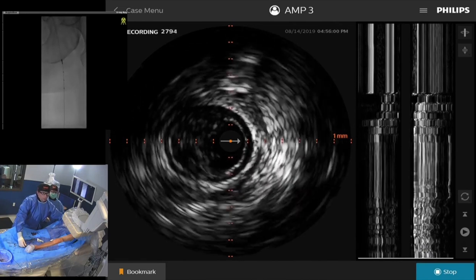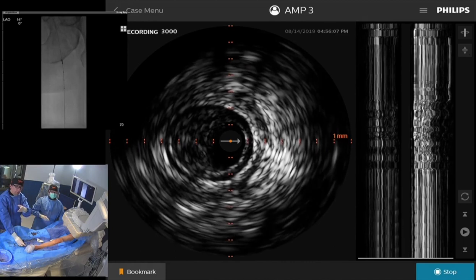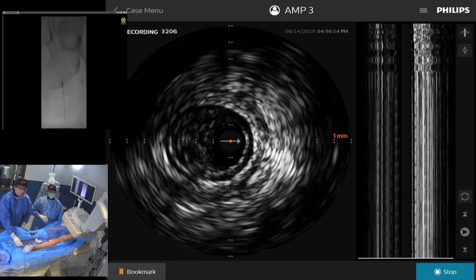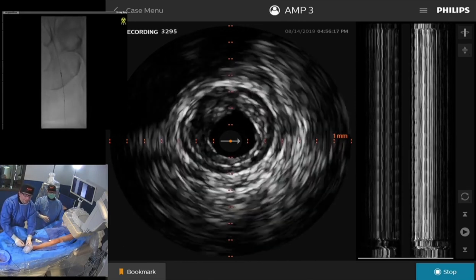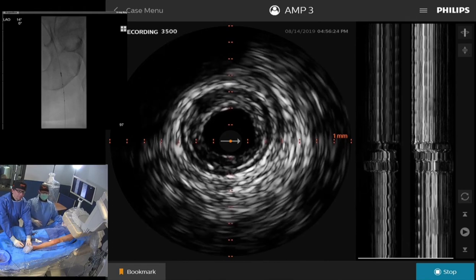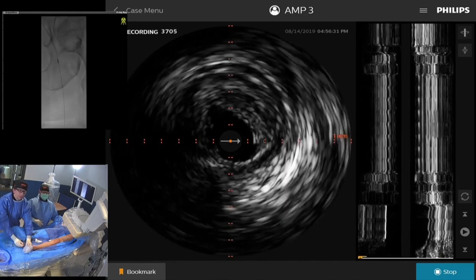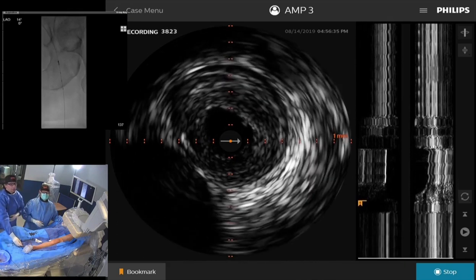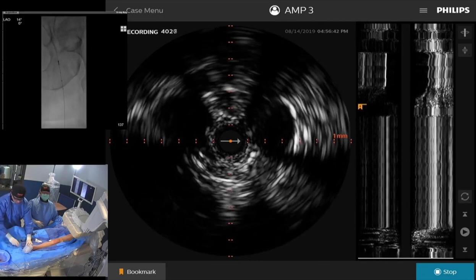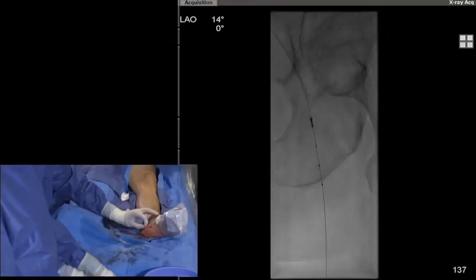George, what do you think? There's one spot — look, you can see the intima, media, and adventitia pushed out — we're subintimal there. But we're going to let go. That is obvious by ultrasound. Actually the SFA here at the common femoral — Faddy crossed right in the center. But the concern: whenever you treat with balloon angioplasty or stenting, you run the risk of shifting plaque into the profunda. Which laser would you choose to accommodate the central crossing?